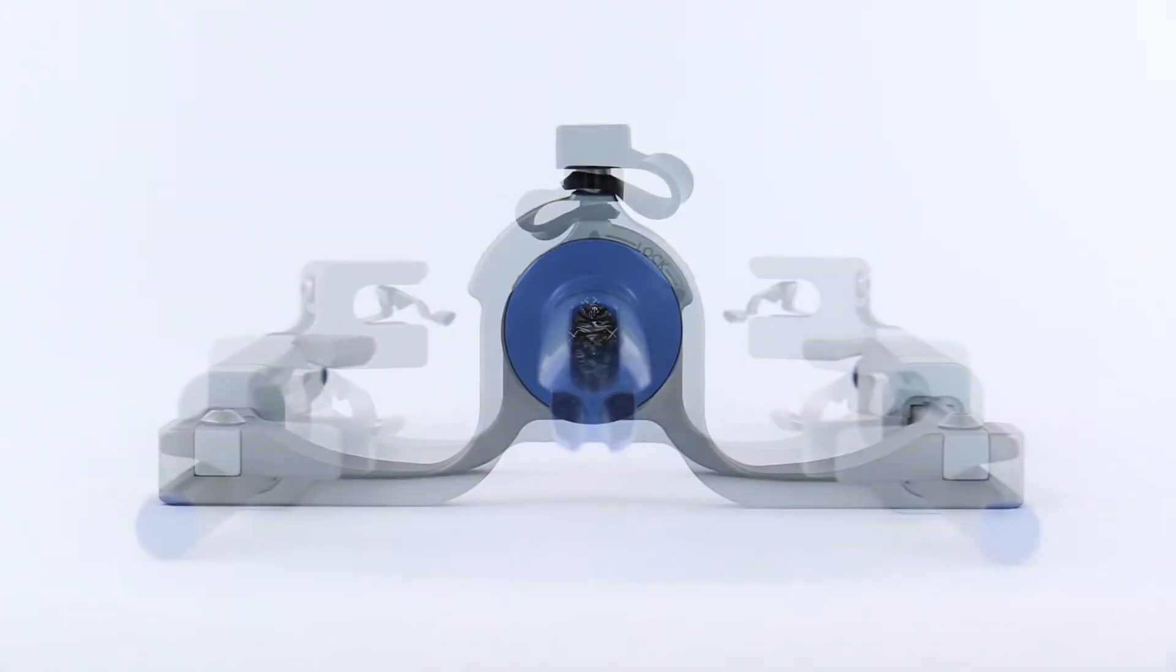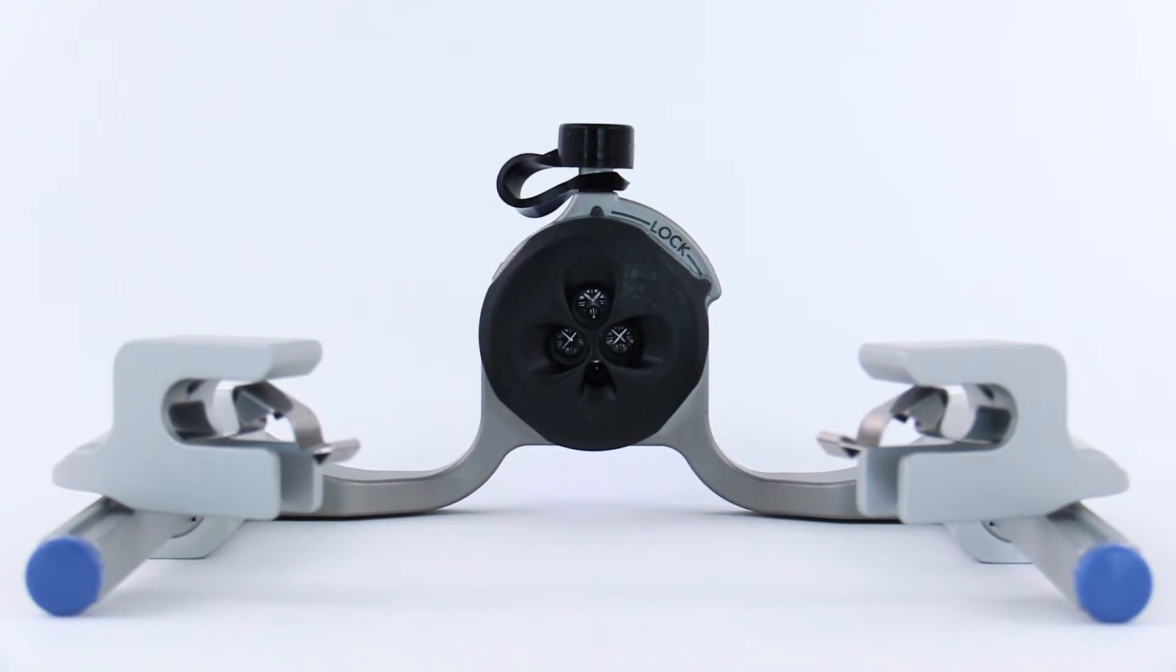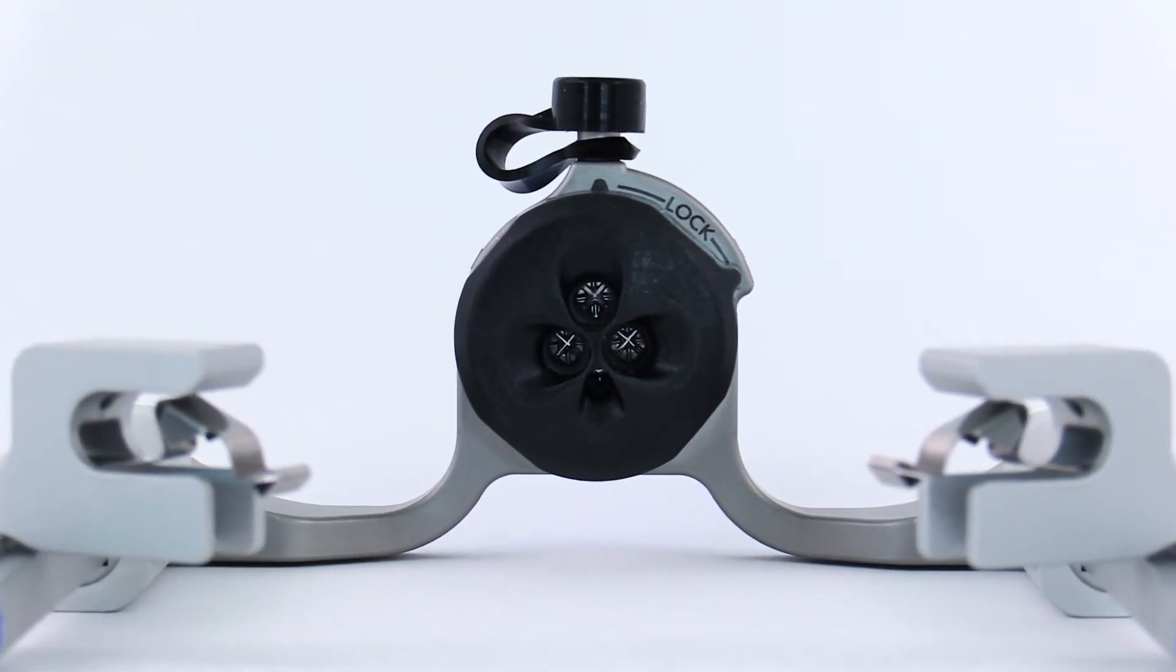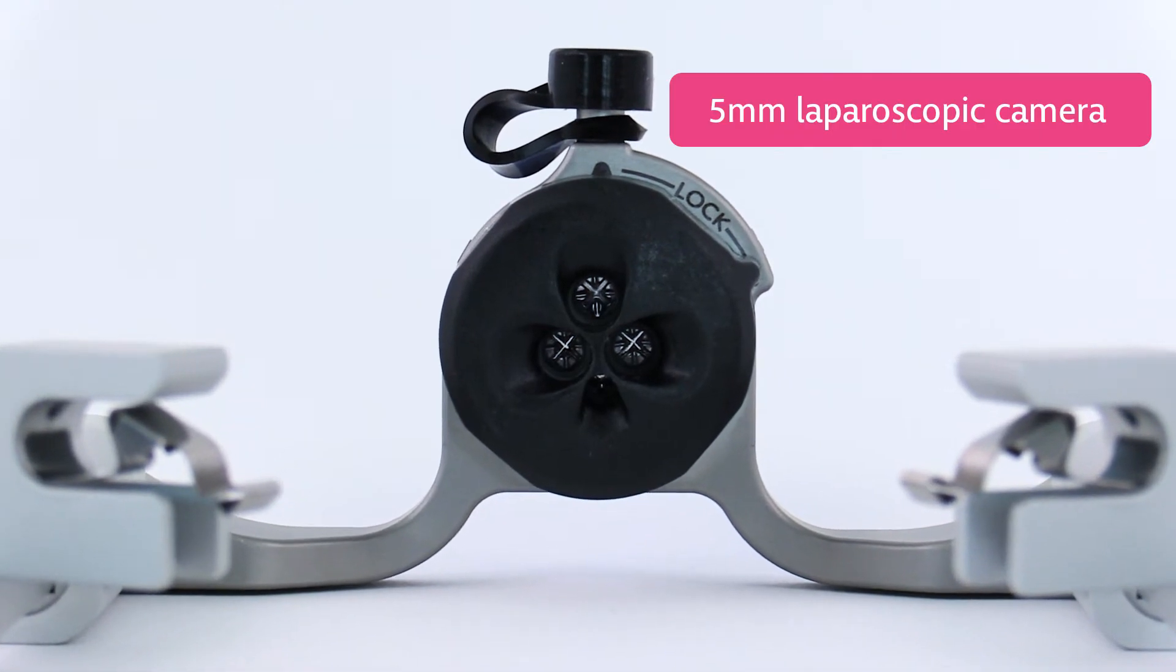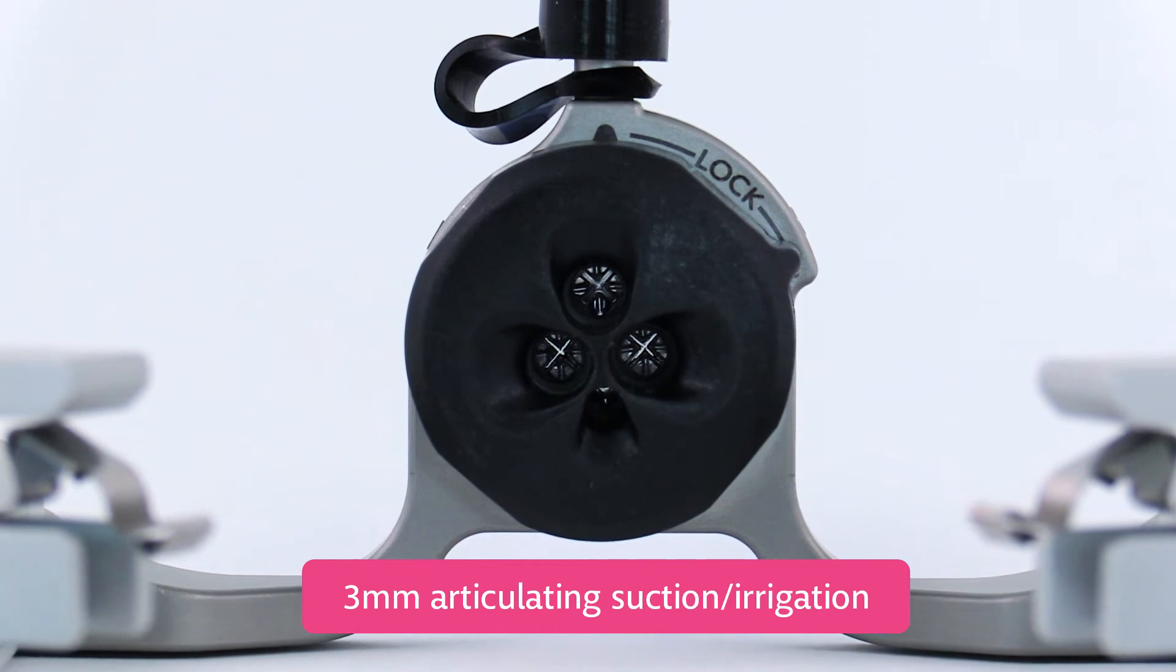Once stabilized inside the trocar, the introducer's four access ports can accommodate various devices. There are two lateral ports for the five millimeter Symphonics instruments, a superior port for a five millimeter laparoscopic camera, and an inferior port for suction and irrigation.